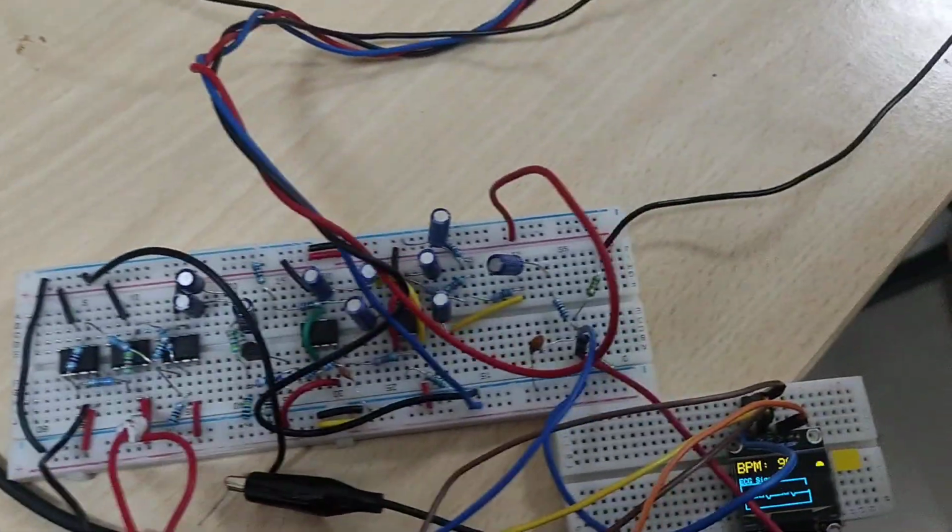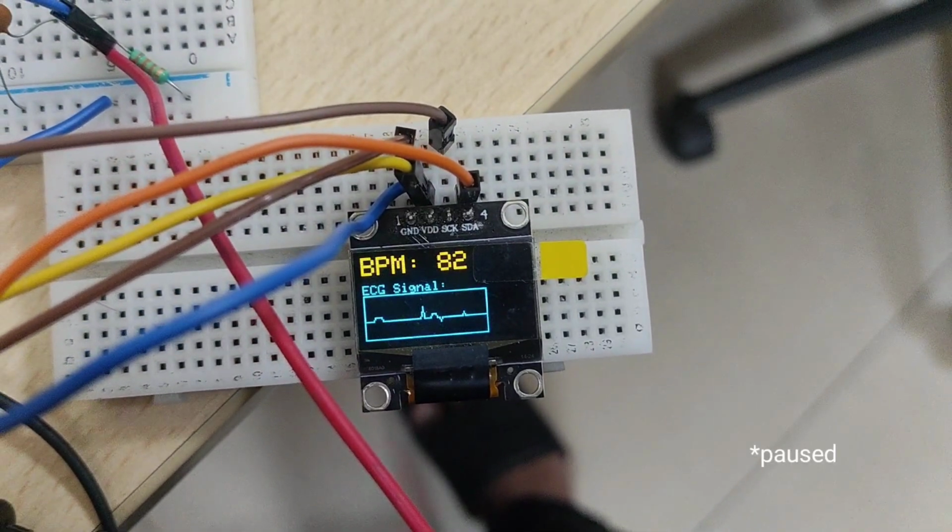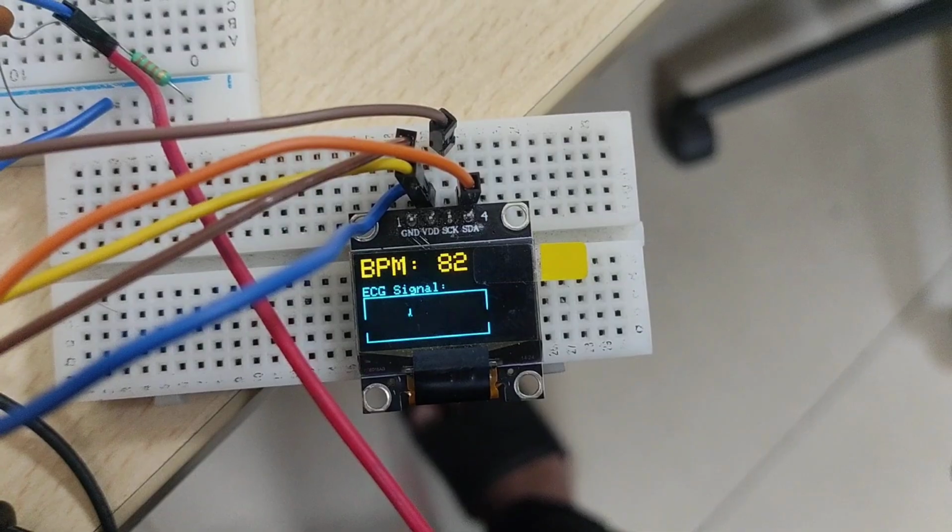Beyond displaying the ECG waveform, we also implemented heart rate calculation using an Arduino Uno. The Arduino samples the conditioned signal, detects R peaks using a threshold algorithm, and calculates the heart rate based on the time between peaks. This heart rate is updated every 10 seconds and displayed on an OLED screen, giving real-time feedback about the subject's cardiac activity.